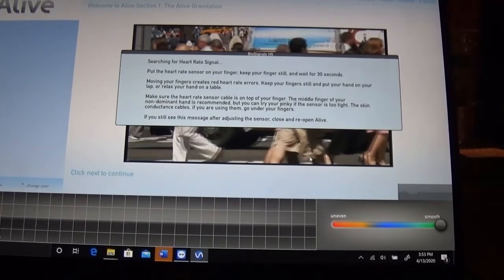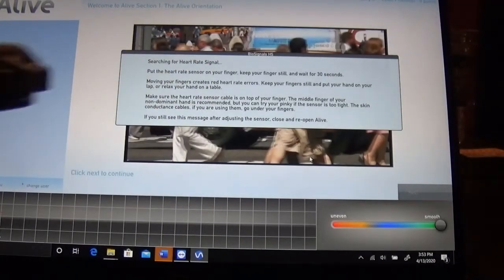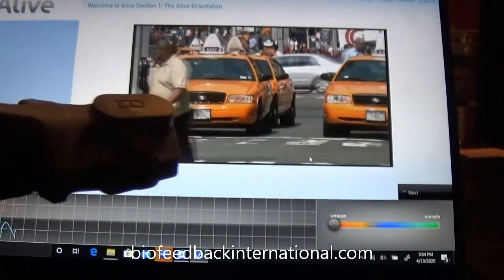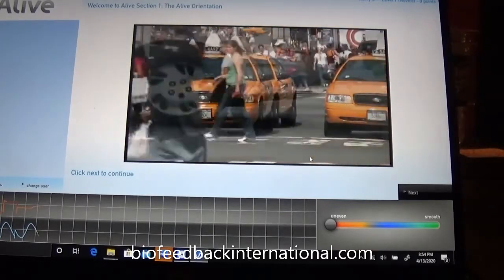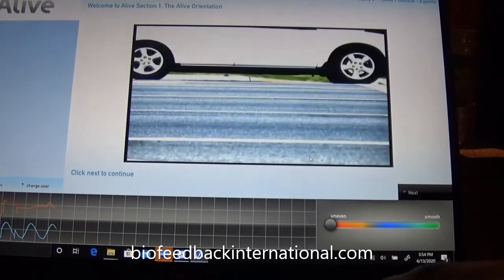So the next thing I'm going to do is show you the software. Right now it's looking for a heart rate signal and it's not getting a signal because I don't have the sensor connected. So I'm going to put this on. Now I have the sensor on. The rate of change in our lives is constantly increasing, bringing extraordinary pressures and stressors of daily life. Now it's picking up the signal.